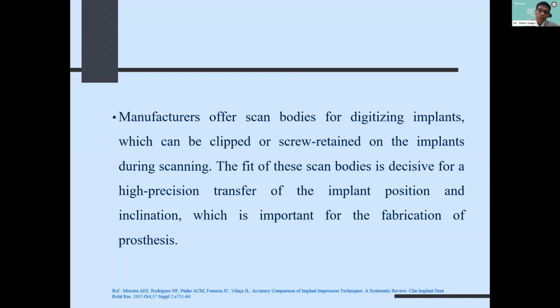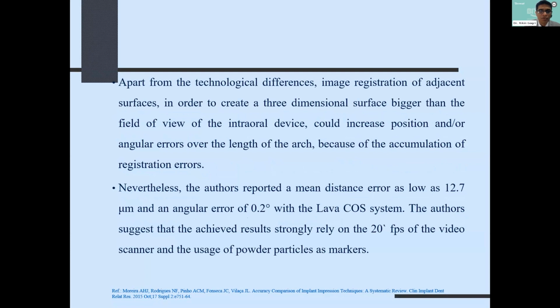This also allows you to explore other CAD/CAM options like the tie base and the custom smart abutments, and that is why digital dentistry is almost something that will now make the regular impression making obsolete. Again, the beautiful advantage of digital dentistry is that it can be used for patients who have a gag reflex, or who have come for the second stage for uncovering. If there is not much bleeding, you can immediately record and minimize the number of visits to the office.